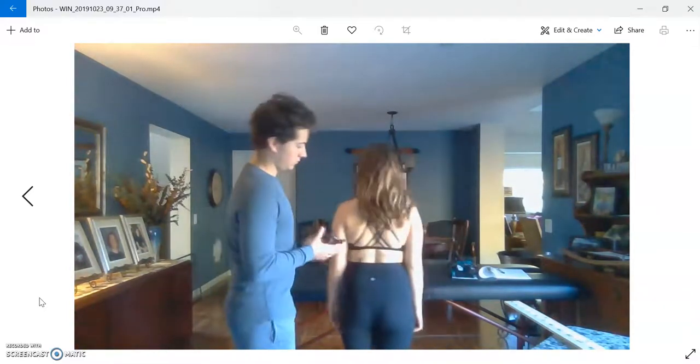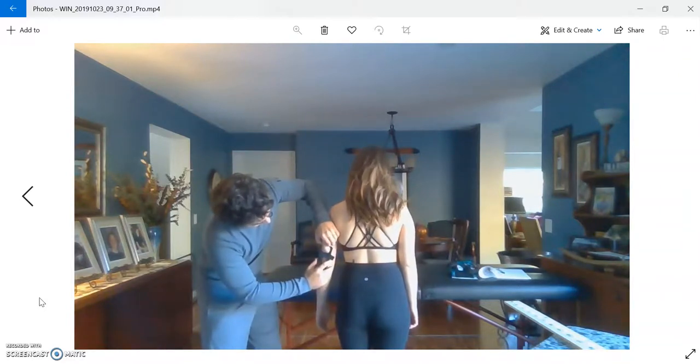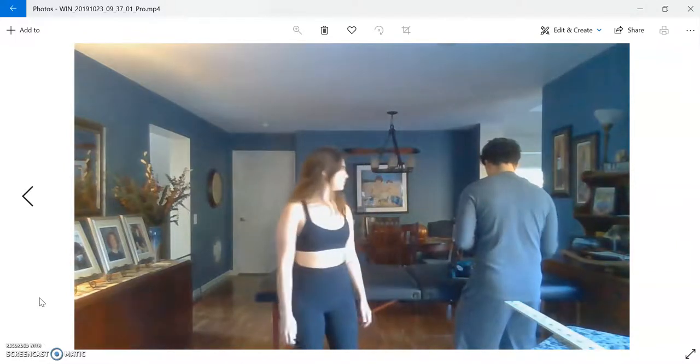Next, we have the skin fold assessment, where I have my client turn around backwards by pinching the back of her arm and holding it there and using the apparatus to pinch down and record my results.